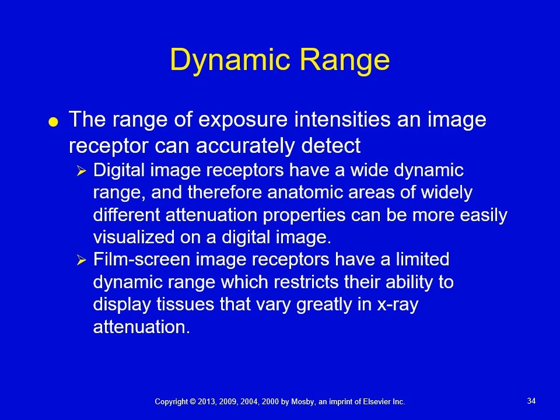If it's underexposed, as long as it wasn't gross and your image was not noisy, meaning grainy, then you can still fix it in post-processing, and your computer would try to fix it before it got to you, but you could still make some changes via window level post-processing. We did not have that ability in the film screen world. What you see is what you get.